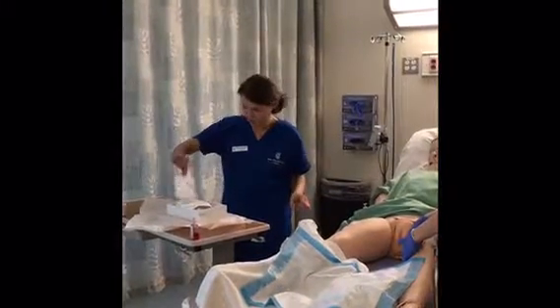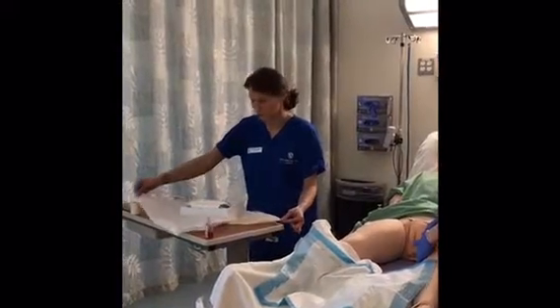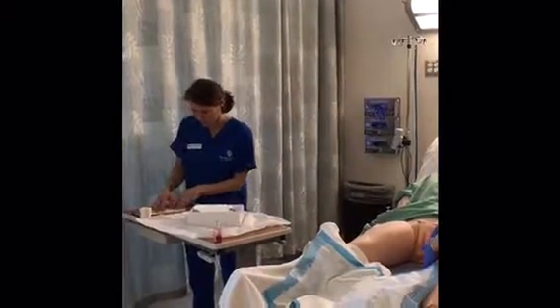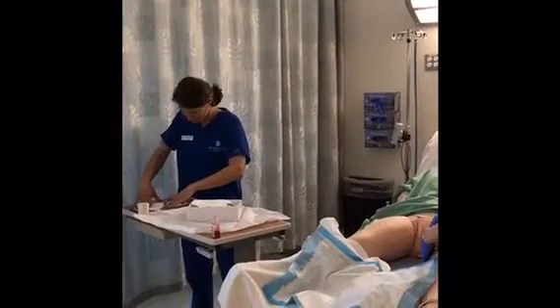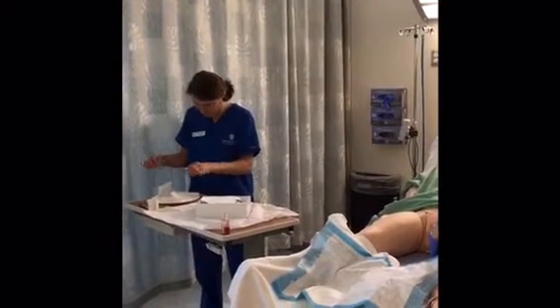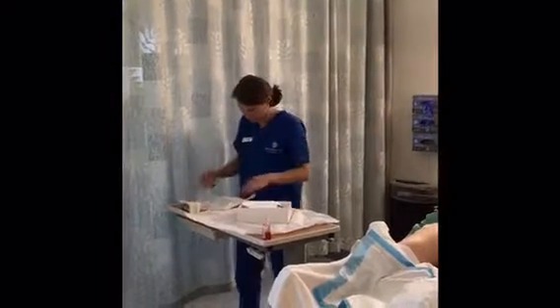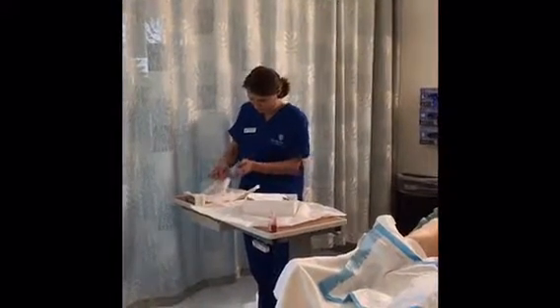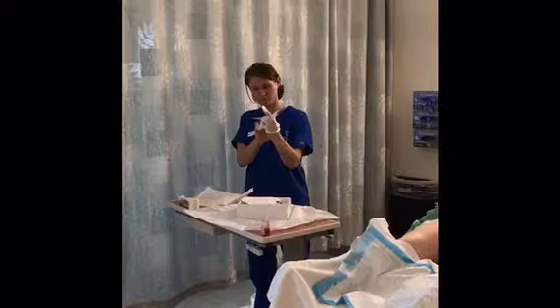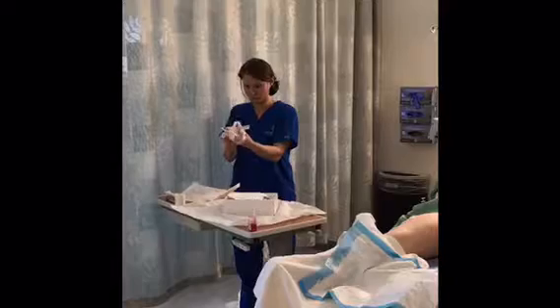I'm going to remove the gloves. Just rearrange my sterile field, noting that I have a 1-inch contaminated border around my sterile field. I'm going to put on my sterile gloves. Close.